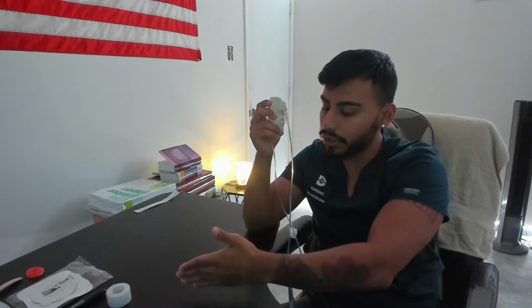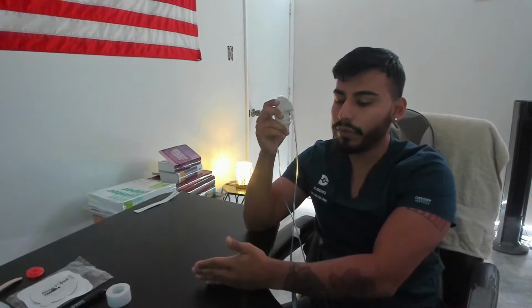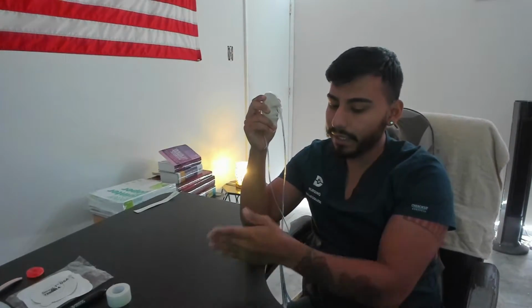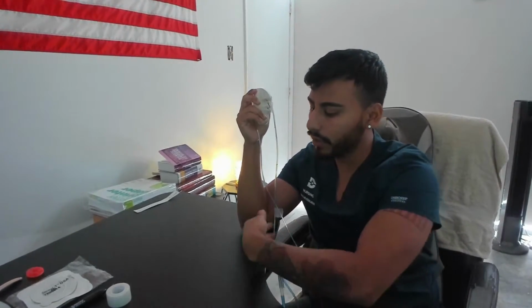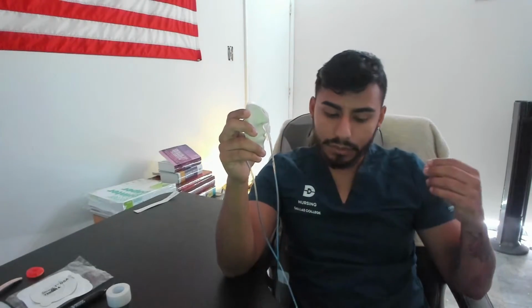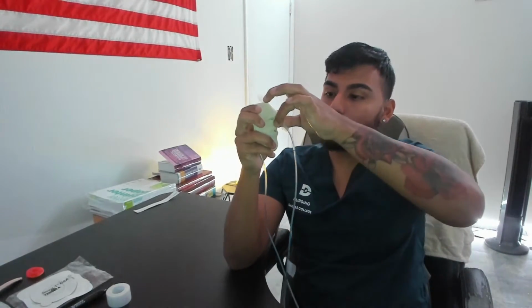Again, I will have the patient's bedside ready. I would have a towel over the patient's chest, tissues, and drinking water. We verified before that Jack Buzzard is indeed not NPO, so he can have that drinking water in an emesis basin, and again some tissues. I will tell Mr. Buzzard, can you take a deep breath in and hold it. Okay, he's holding it. I pinch the tube and go completely out, smoothly, quickly, gently, and then the tube is out.